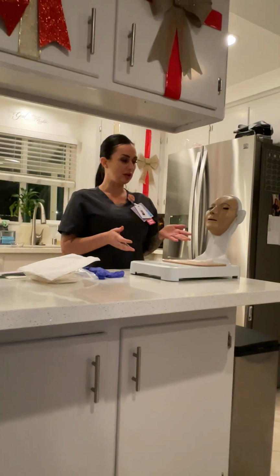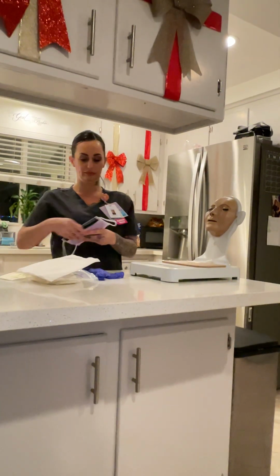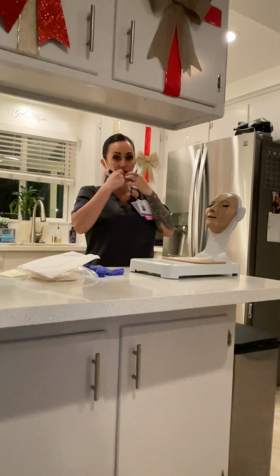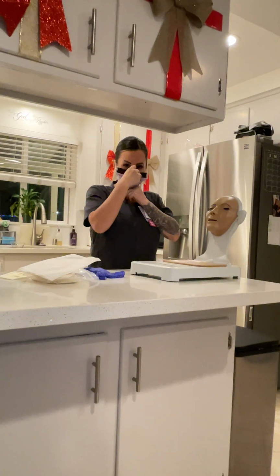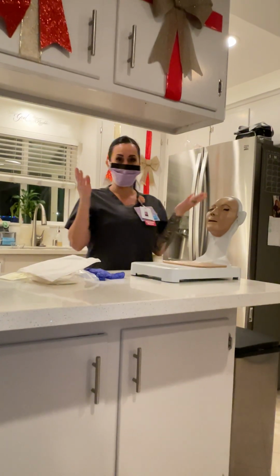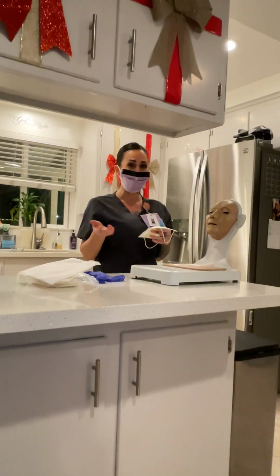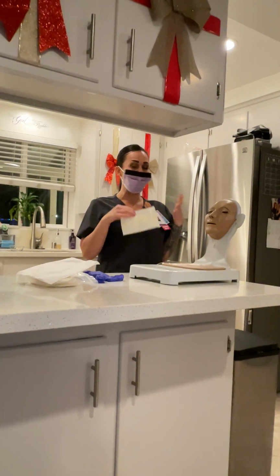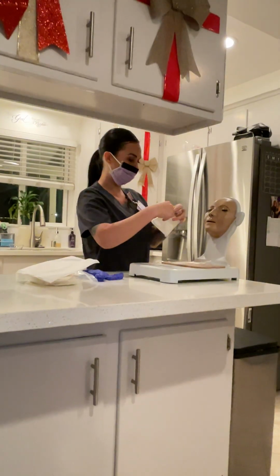So the first thing that we are going to want to do is place a mask on ourselves. Then we're going to ask our patient to put a mask on, or if they can't do it, we can do it for them. And if they can't, then of course they can turn their head away from the procedure site. As well, if we have anyone else in the room or in the vicinity of our procedure, they need to be wearing a mask just so they can maintain sterility for the central line. All right, we're going to put your mask on.